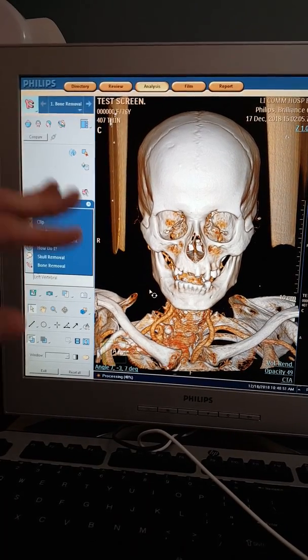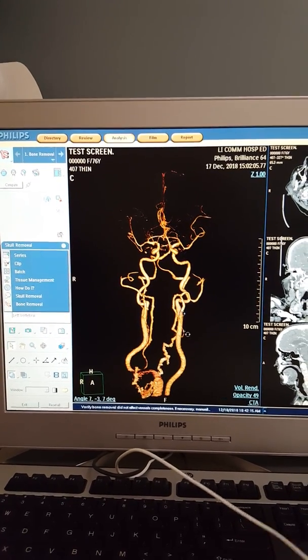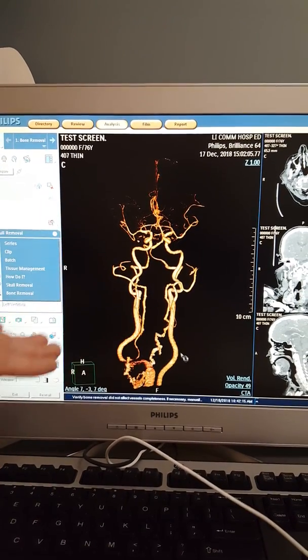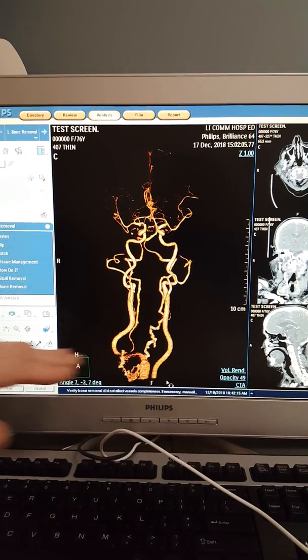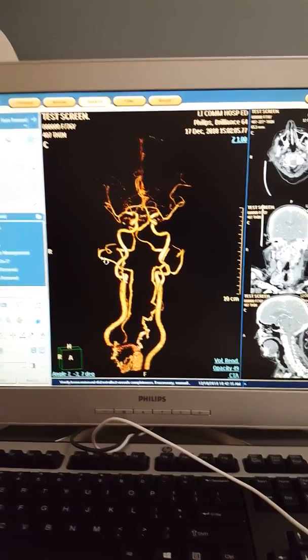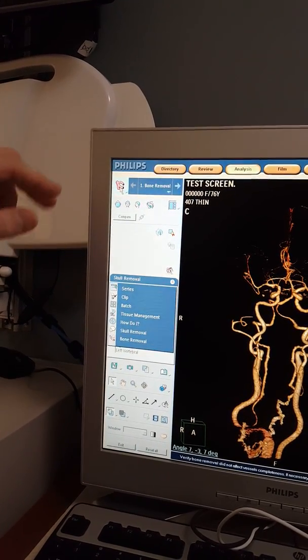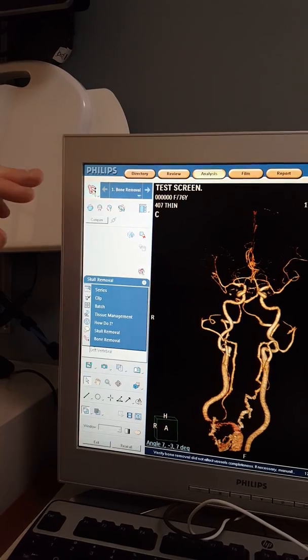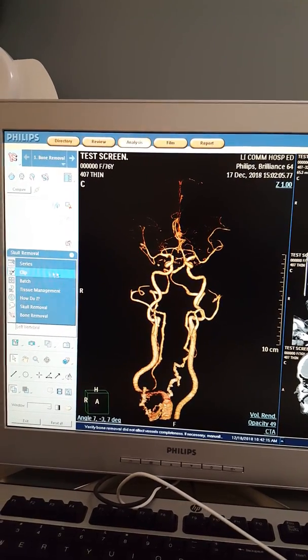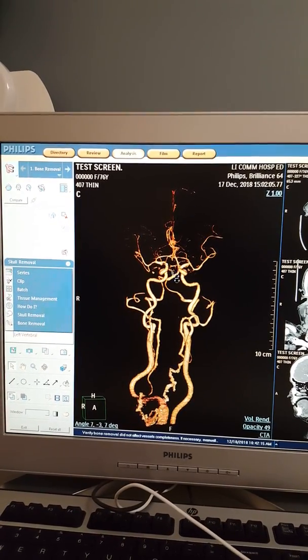Now we can see the bone has been removed from the head and neck. Before getting to any of this, you take your thins from the bottom of the screen — where it says thin, coronal, sagittal — highlight the thin in blue, then load it into the AVA. Once you take the thins and click on AVA, that's how we got to the bone we saw before. Then we went to bone removal, removed the bone, and it brings us to this.